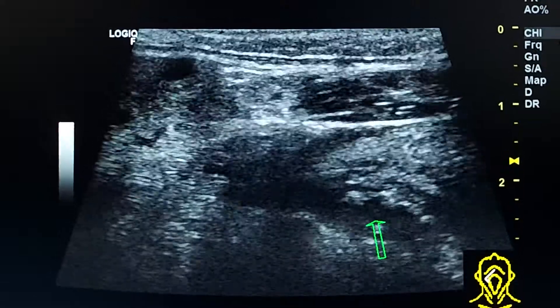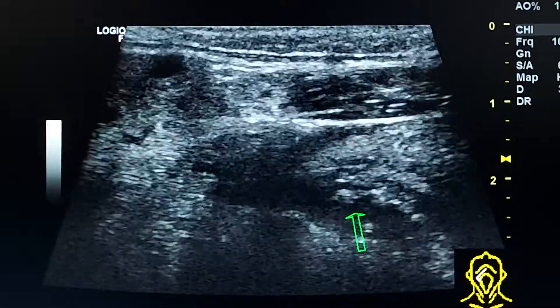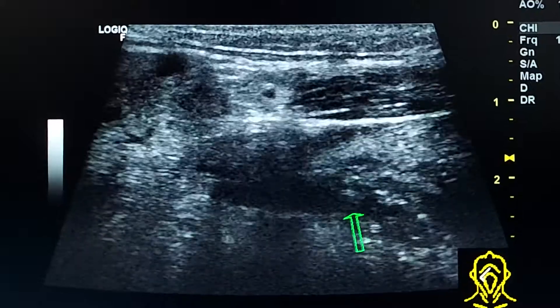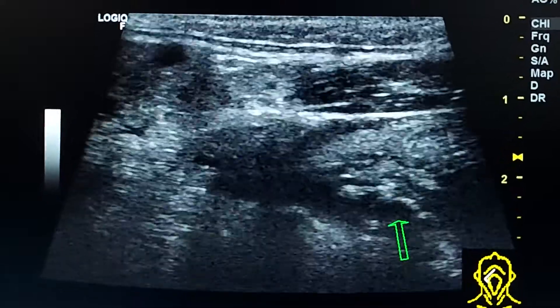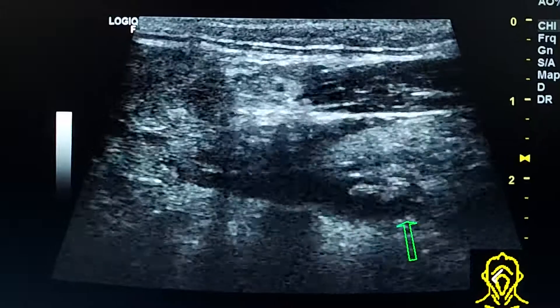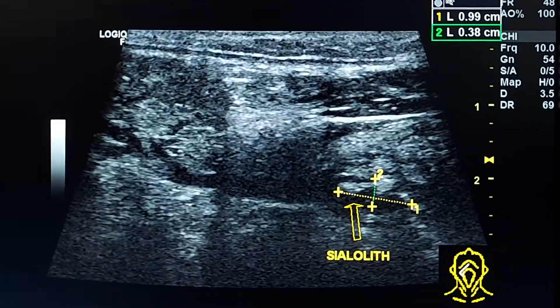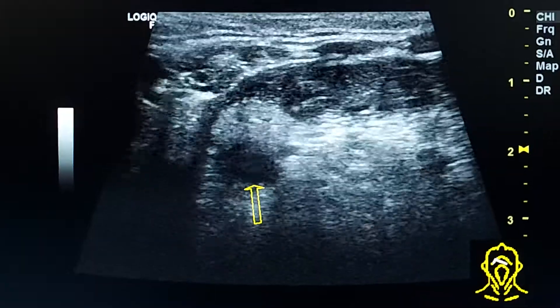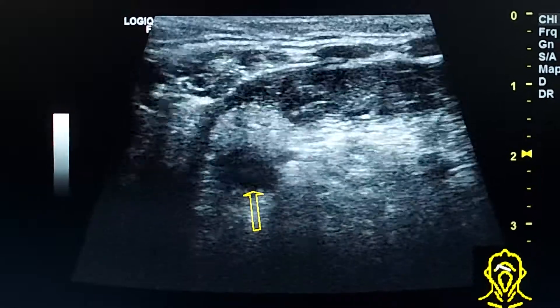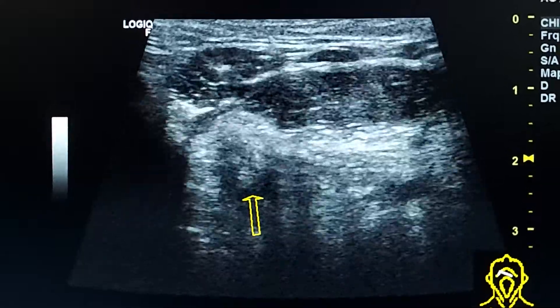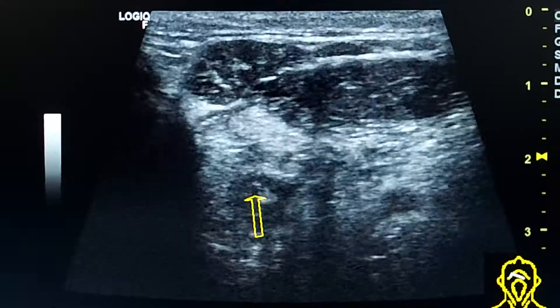Here at the distal part of the duct we see a calculus obstructing the lumen of the duct. Here is the duct in transverse section — we can see the stone inside it.